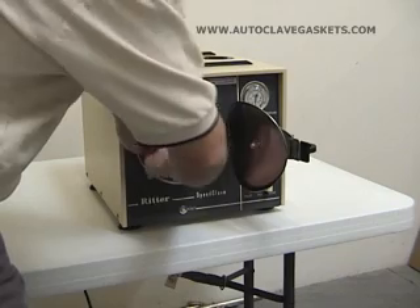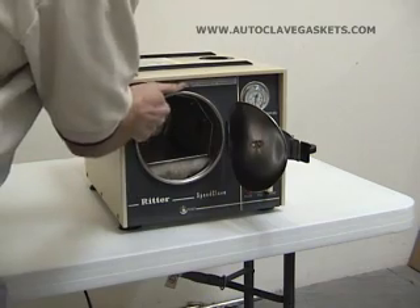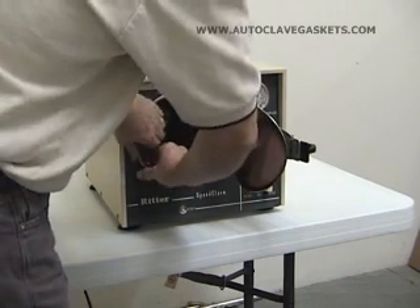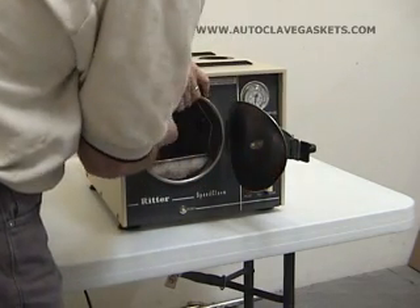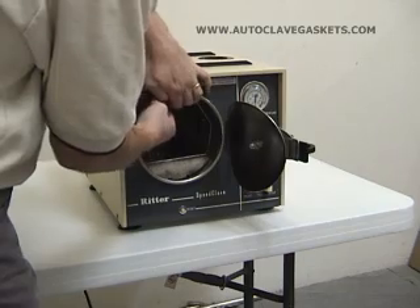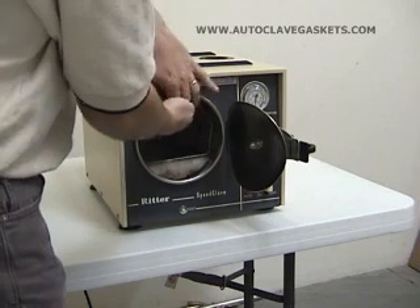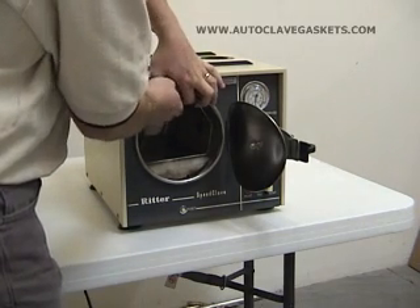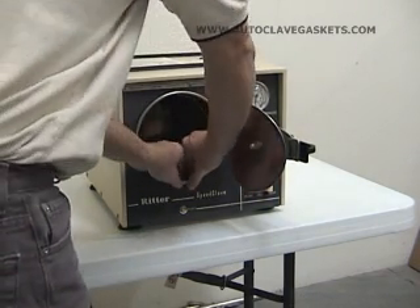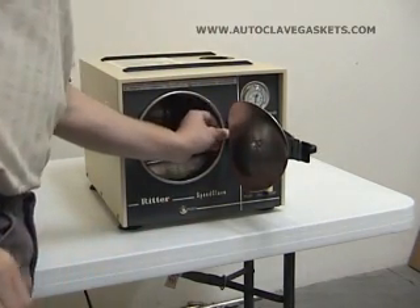Do the same thing on the other side — just keep working that excess back up in there. It does take a minute. One of the things I will recommend against is using any kind of solution, soap or anything like that. What you really want for this unit is for the gasket to be dry and kind of a little bit tacky, because that's really going to stuff it up into that groove nice and tight.